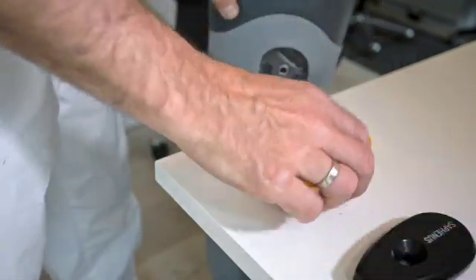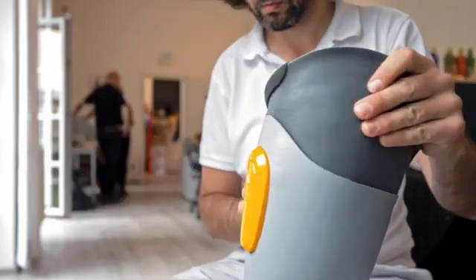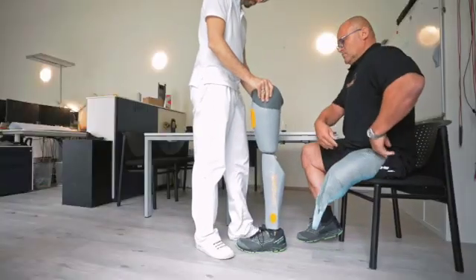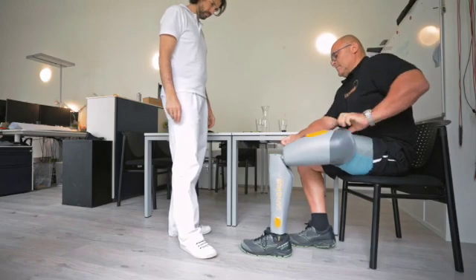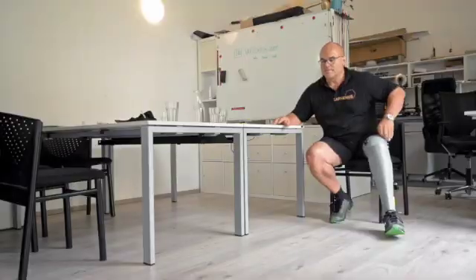Sensors and actuators are separated to allow individual adaptation to the specific requirements of individual patients. The sensory feedback system is the first medical device in the world which helps through the idea of embodiment — the prosthesis adapts to the body, and not vice versa.